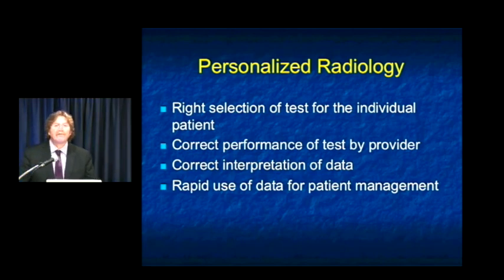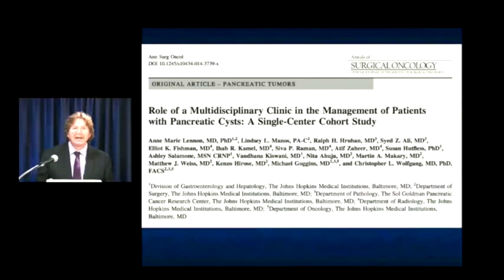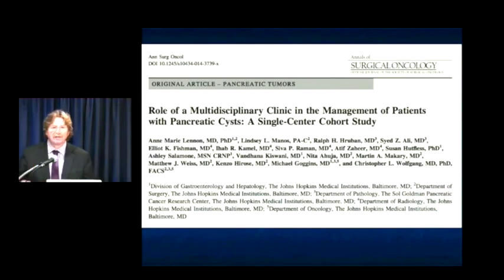Also, it's important for us to be part of the process, work closely with referring docs. We need to be the ones who know what the right test is. We need to perform the test correctly, interpret it correctly, and provide the information for patient management and be involved in management. Things that are critical are multidisciplinary conferences.